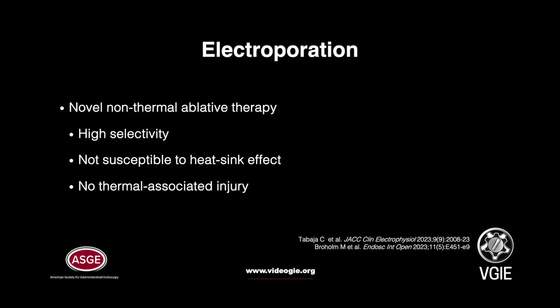Electroporation is a non-thermal ablative therapy. The major advantages are the high selectivity of the ablative effect. It is not susceptible to heat sink effect caused by surrounding vascular structures, and there is no associated thermal injury.